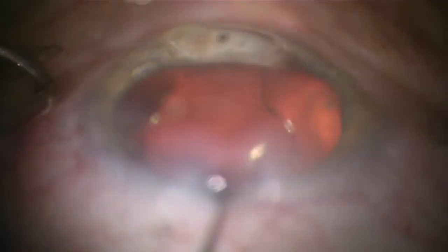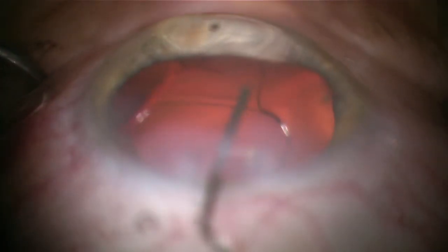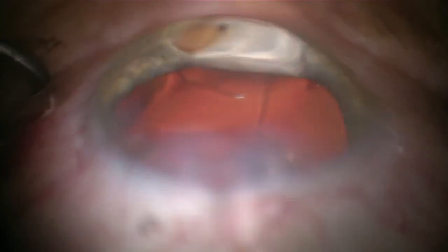I'm going to turn throughout two o'clock hours away, but now I'm seeing the chamber flattening a little bit and some folds in the cornea. So don't worry — just come out, take an extra step, fill the anterior chamber with some more cohesive viscoelastic, and put some more on the cornea. By doing that, you're going to give yourself a little better view.